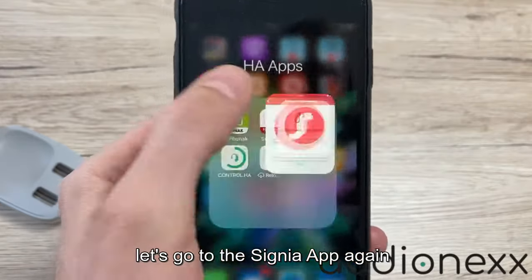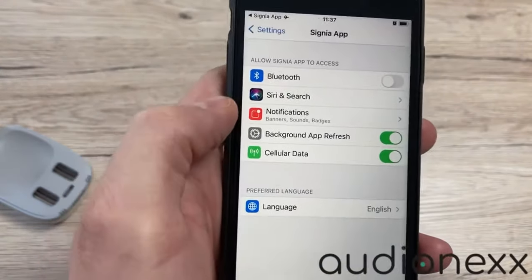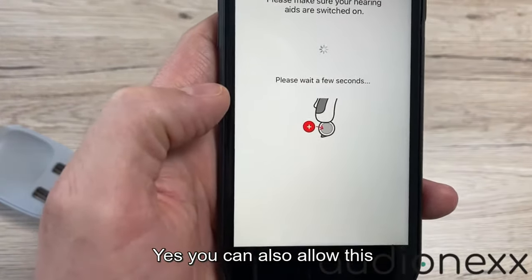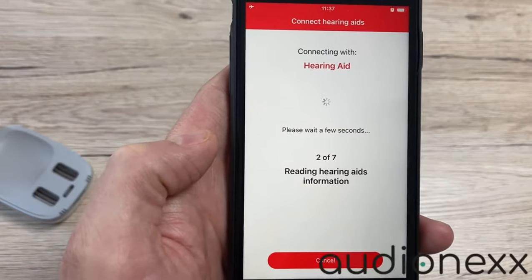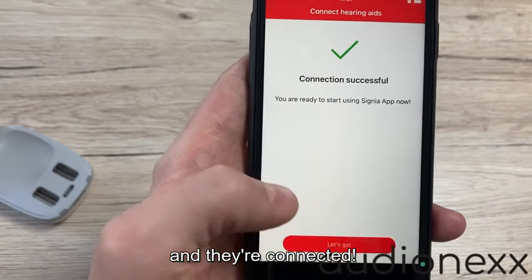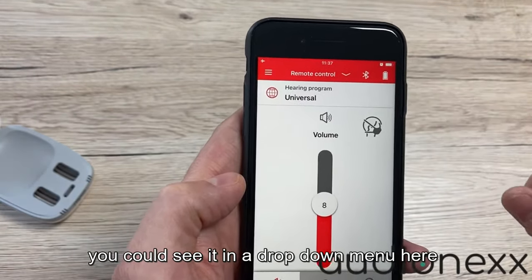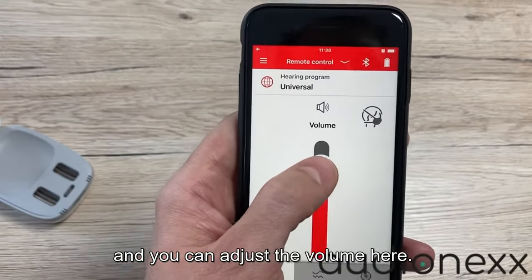Let's go to the Signia app again. It asks for a few permissions, and now it's searching. If you're using rechargeable hearing aids they've already turned on — just wait a few seconds and they're connected. So what we've got here: one hearing program — Universal. If we had more hearing programs you could see them in a drop-down menu here. We also have the mask option, which gives you a little more volume, and you can adjust the volume here.